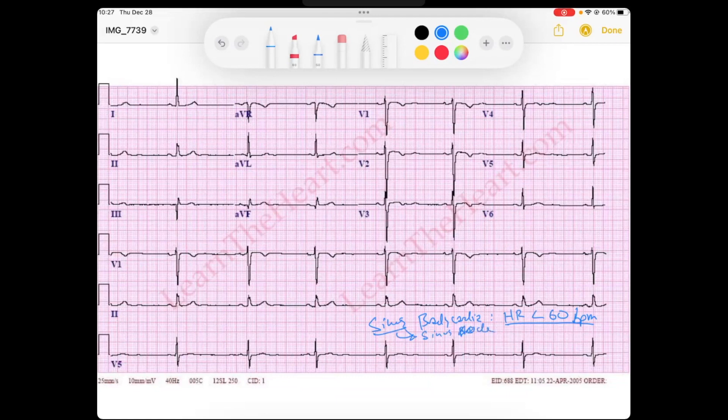Sinus node. So, first of all, I want to just go through this rhythm. So we see these narrow QRSs here. Let's get a rate. You know, they're quite regular. We know the sinus node is a regular node. It does not beat erratically very often.